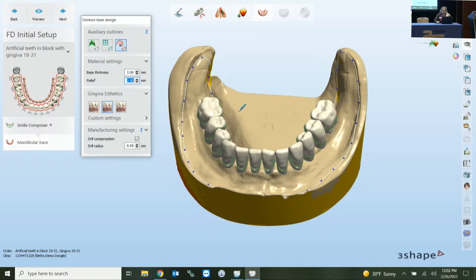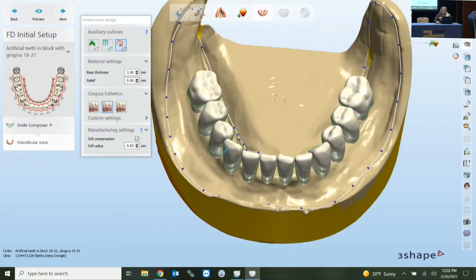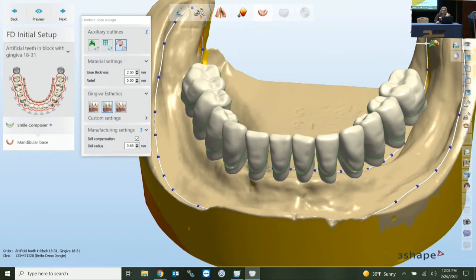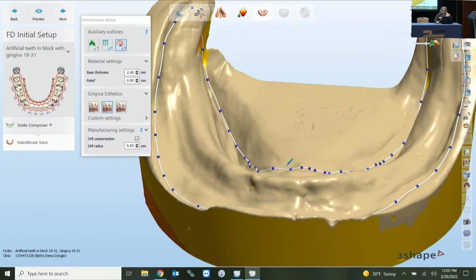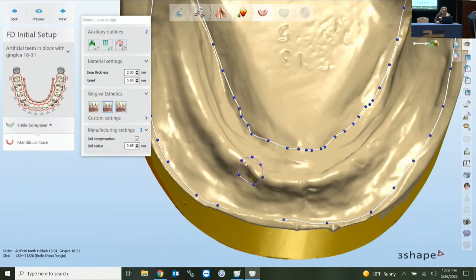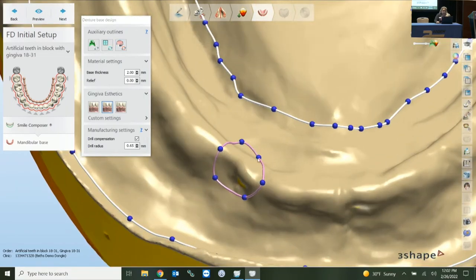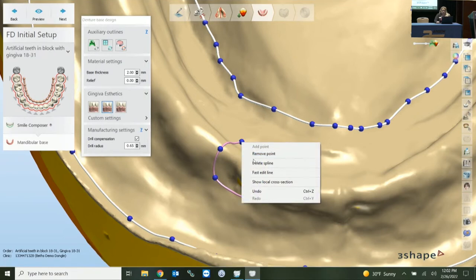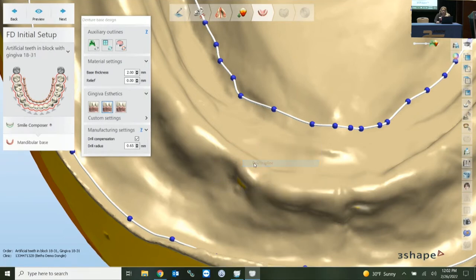Once your pencil is activated, you come in and draw a circle around the area. You can see the spline color is different — it's pink, giving you a visual cue that it's different from your actual outline. You can right-click and delete the spline as well. On the left you also have base thickness — let's change that to 2.5 millimeters.